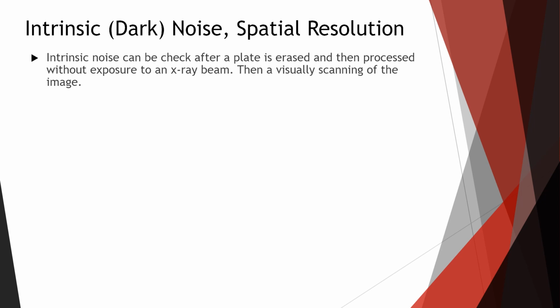There shouldn't be any major inconsistencies in the snow. Okay, there shouldn't be any really dark spots, any really white spots. If there is, there's a problem with the plate in CR or in DR. If we recreate this process, it should just be uniform static. Okay, it should just be uniform background.